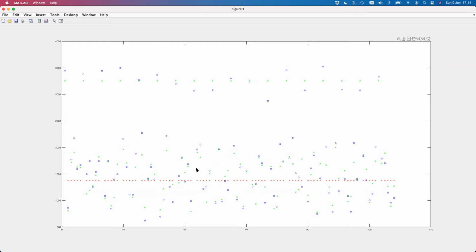But if we look at the diffusion weighted signals with the B values of 1,000, unlike the previous model where it just estimates the same number for every single one, now that we've got diffusivity as a function of direction by the diffusion tensor, you can see that the green crosses, the estimated signals, vary quite widely and actually much more closely approximate the blue squares, which were the original measurements.